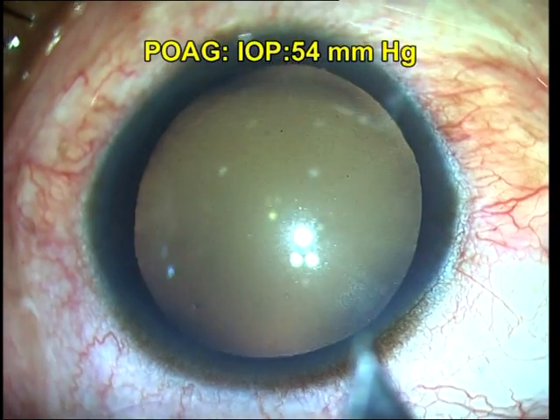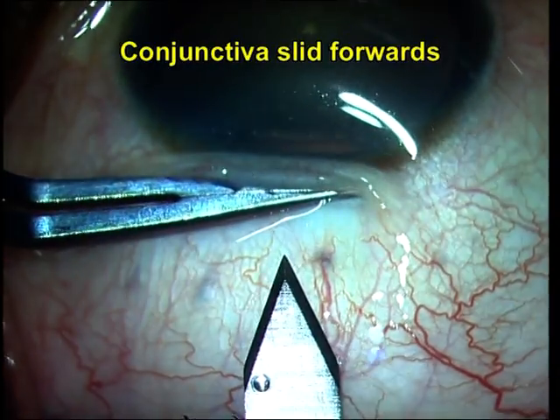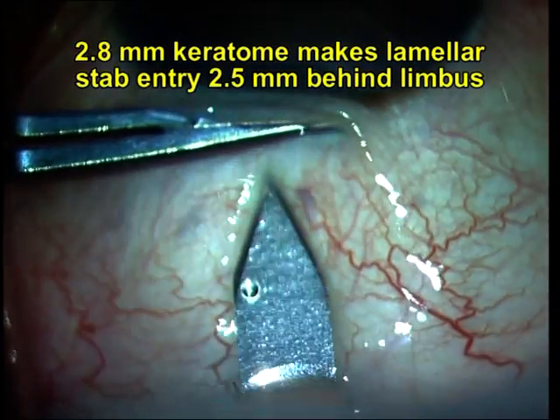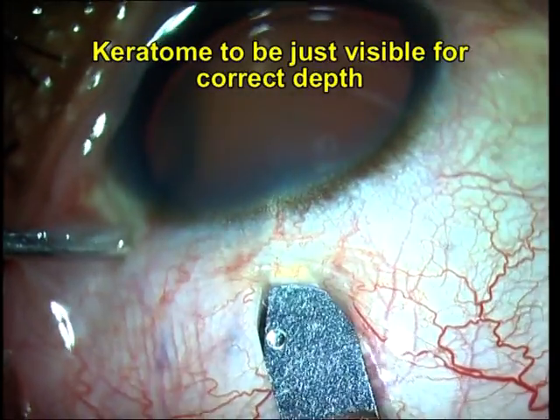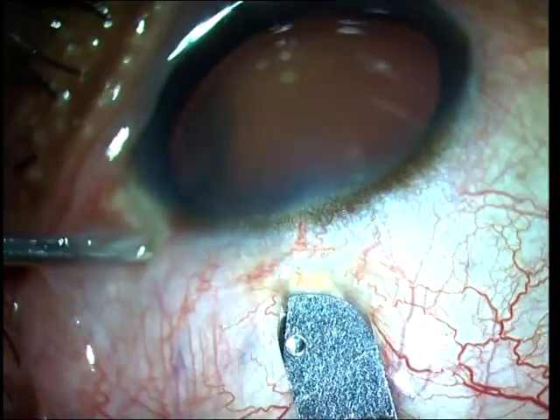This particular case is one where I also combined it with FACO. What I'm doing basically is sliding the conjunctiva forward as you can see with a blunt instrument, and I've taken a 2.8 mm bevel-up keratome and I'm making a lamellar dissection through the superficial sclera till I reach the limbus. The right depth for the keratome is in such a manner that it is just visible through the conjunctiva.